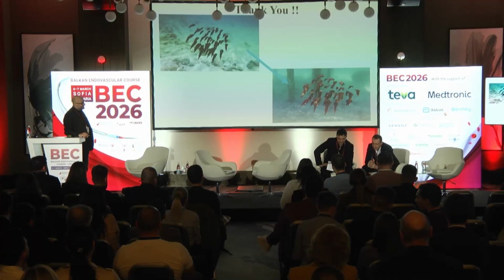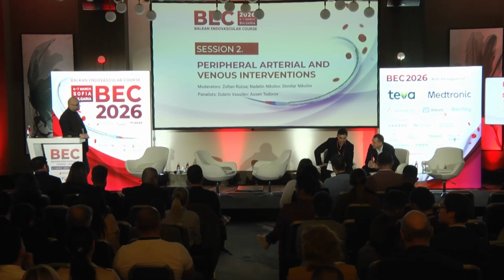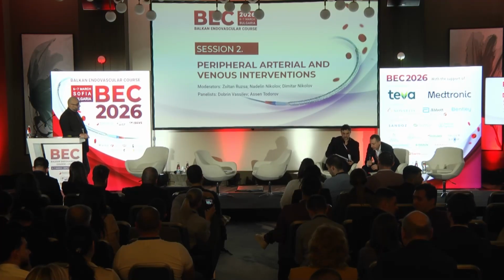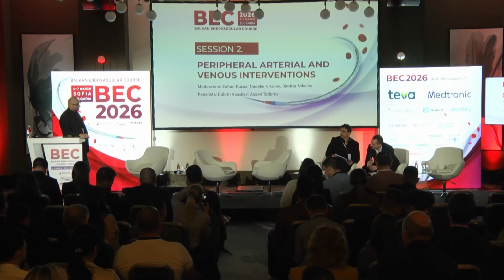Questions? Okay. If I can. Thank you very much. Excellent presentation. I totally agree that we need something more than angiographic control and angiographic indications for treatment of the lesions of the lower limbs. And this is something very, very positive because it's functional, and we really can imagine what happens, especially if there are lesions we are not sure should be treated more, and so on. So, very good. Thank you.